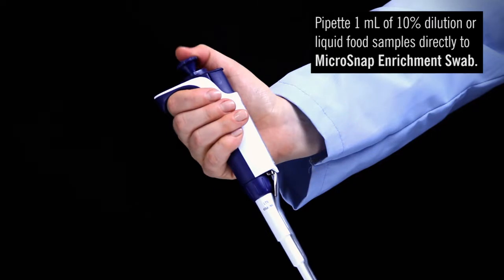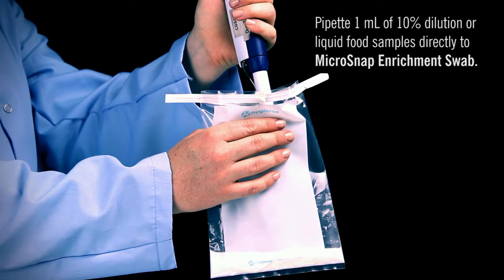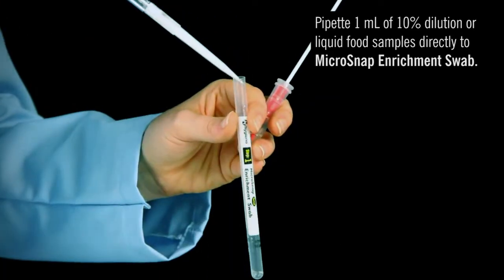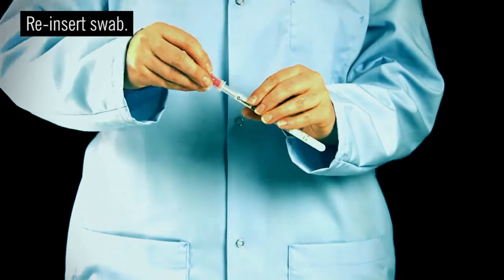For product sample, you may prepare a 10% dilution or add 1 milliliter of liquid food samples directly to the enrichment device. Replace the swab in the tube.